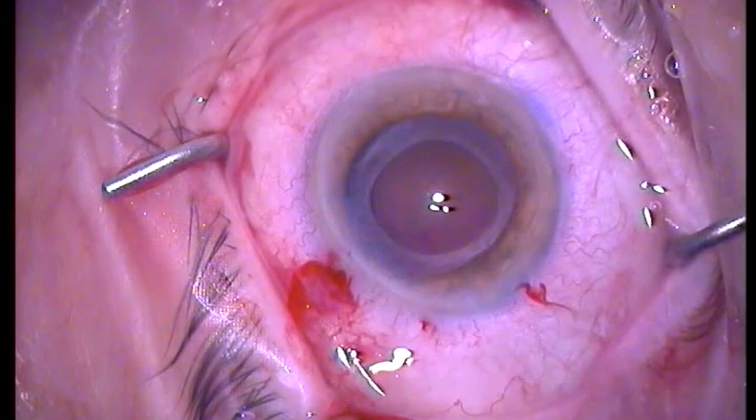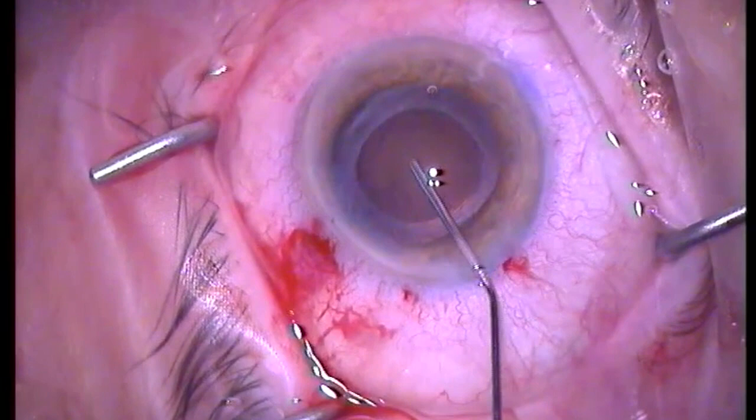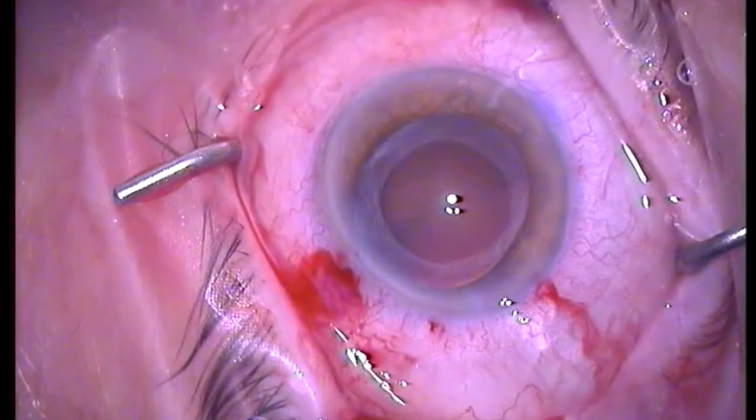Antoinette was a very pleasant lady, 71 years old, and really wanted to improve her quality of vision. She was troubled a lot with glare, and I explained to her that a monofocal lens — a ZCB model by Abbott — was chosen after our discussion. You can see here the otherwise routine implantation.